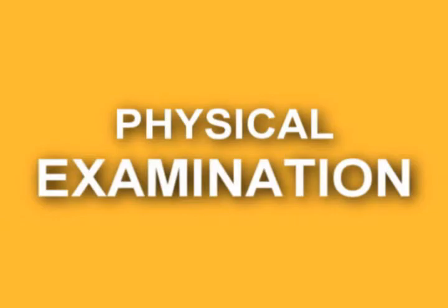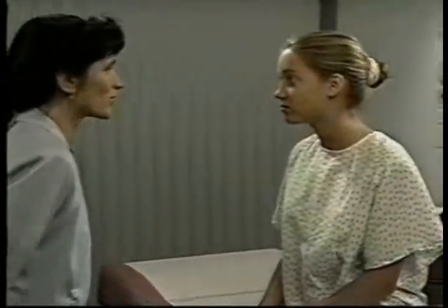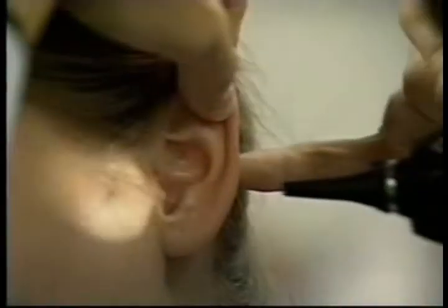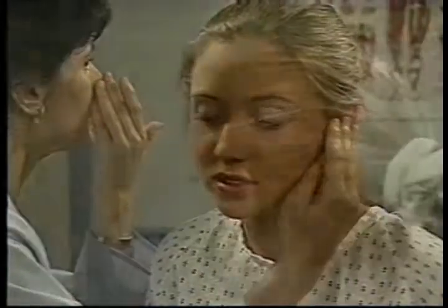Physical examination. This video presents examination of the head, including inspection of the head, hair, scalp, skull, and face. Examination of the eyes, including tests for visual acuity and visual fields, inspection of the eyes, and ophthalmoscopic examination. And examination of the ears, including inspection of the ears, otoscopic examination, and tests for hearing.